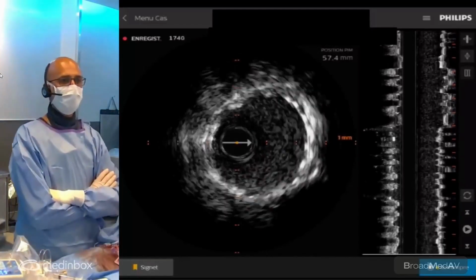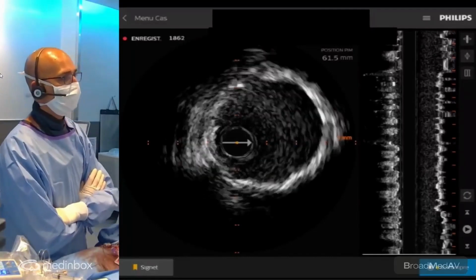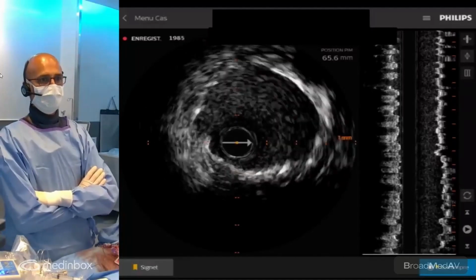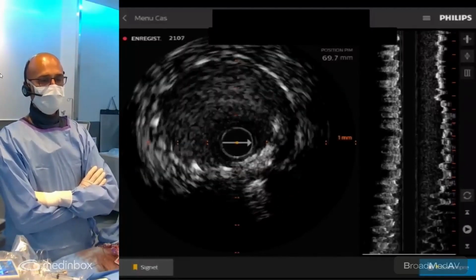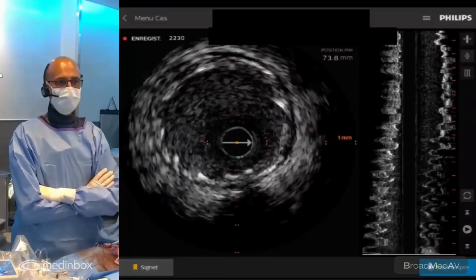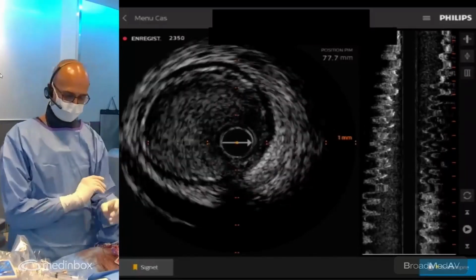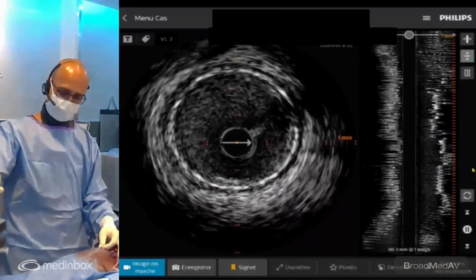Okay, let's get a non-compliant long balloon, please. Okay, proximally, proximal looks good. It's really that body of severe lesion that's suboptimally expanded. There you go. No edge dissection. Looks very good. Perfect. Okay. So a little bit of work to do.